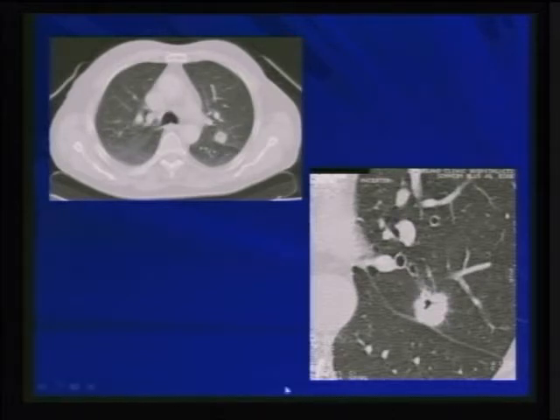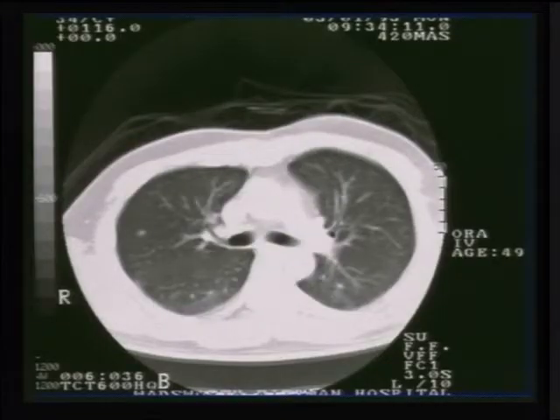As you can see in this patient, this lesion we can tell now that it's spiculated, it has central cavitation, most likely to be a cancer. Again, having thin cuts will help you. This is a patient with a small nodule, hard to characterize, but repeating the study and doing thin slice nodules, you can see that the patient does have central calcification, characteristic of benign granuloma.